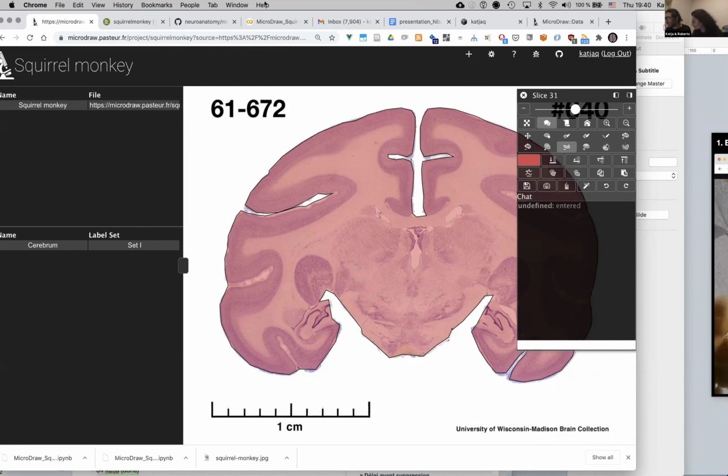There's a question here. Do the annotations need to be closed, or can they just be lines? You can't have only lines. If, for example, you think that there's one cortical area here and one there, then you can draw a line. But it's a different tool. So this is Bezier curves drawing. So yes. Oops, let me see, I was wrong. This is for drawing curves.